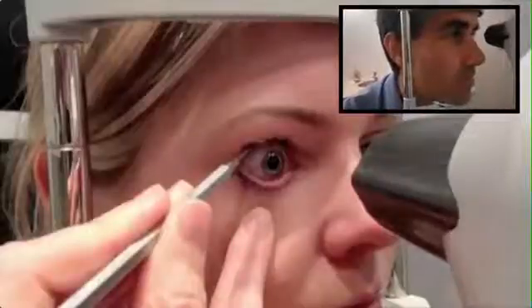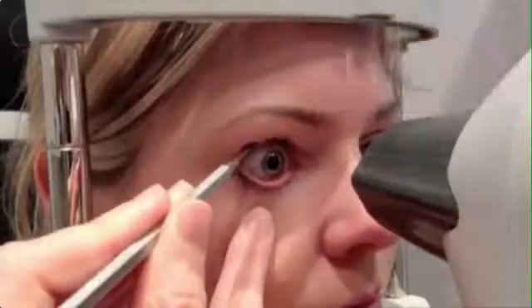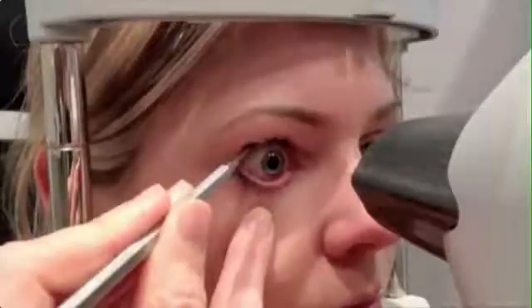Remember, a good head position when setting up a patient on the corneal topographer will allow for easier capture of all corneal topography.